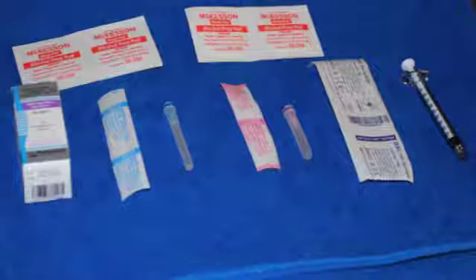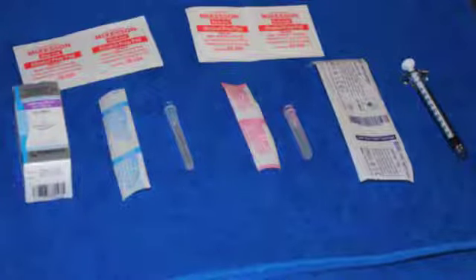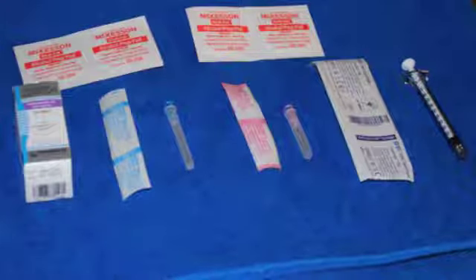Today we will demonstrate the proper technique for self-administration of intramuscular injections. Before we begin, we will assemble the various products and devices that we need to administer our self-injections. I'll review these one by one in a moment.